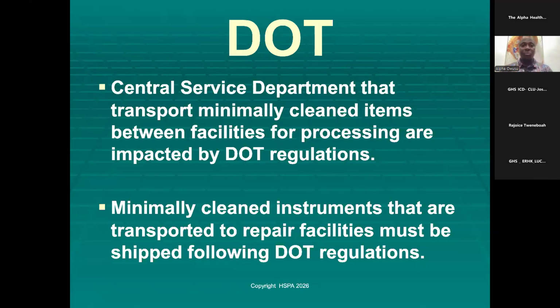Even when they have done the assembling after decontamination and are sending it to the sterile processing department, sometimes you see that they put it on a mobile truck, just like that, with a towel that has even been used in the OR. That transport mode is not the way it is supposed to be. There should be a clear, stringent transport policy to prevent cross-contamination.